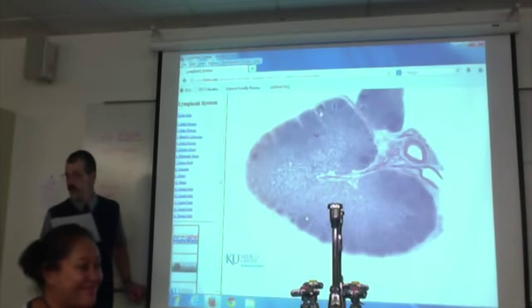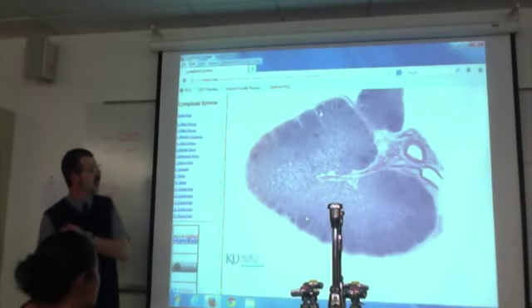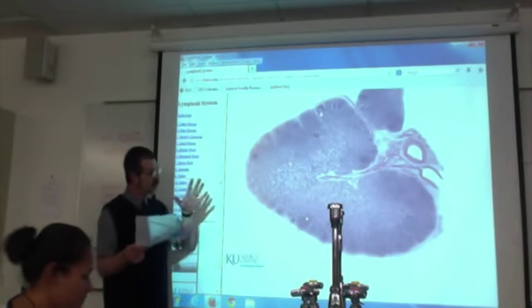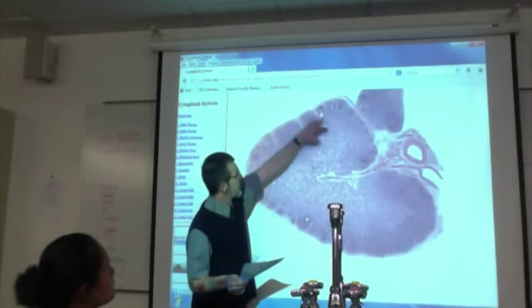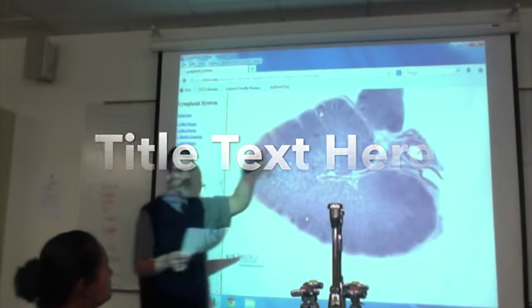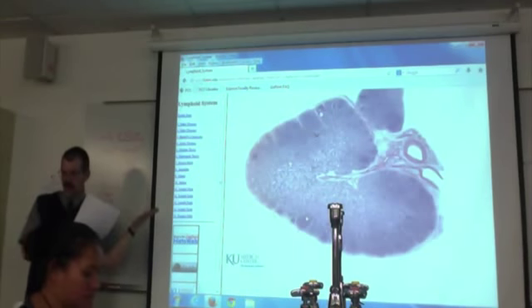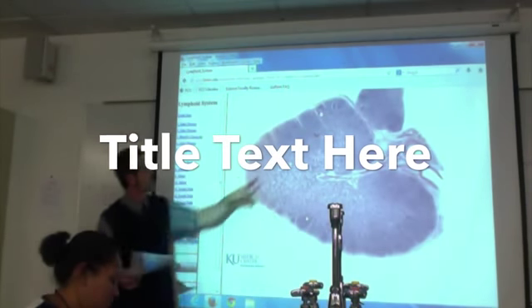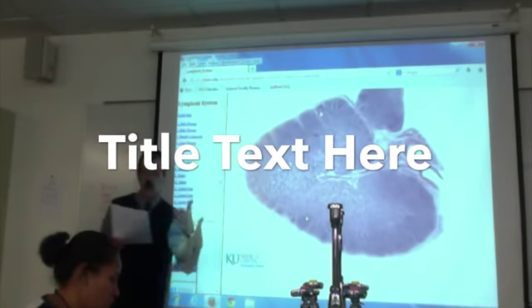What were the medulla? What were the cords? Okay, cords are this odd construction. Depending on who you talk to, you'll get a different definition. I learned that this whole section between the trabeculae was a cord, like a room. If you talk to other people, they'll argue no, it's the vessels within the area. I can see that. So I would say that this is a cord, this is a cord, here's a cord. And by the way, I never ask about cords on any exam.